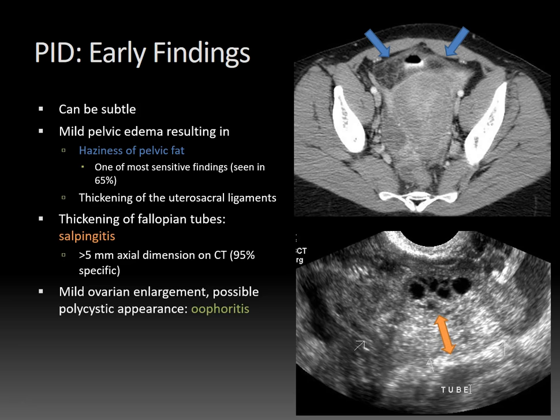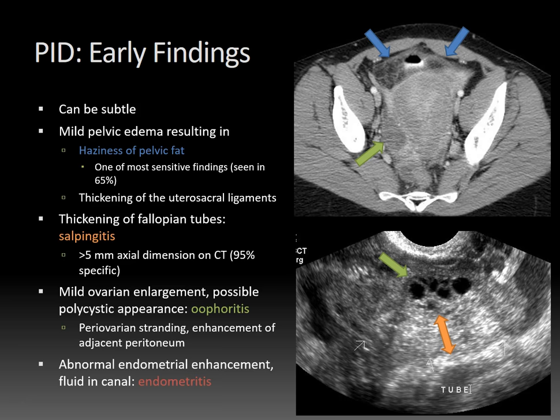Here's an ultrasound case showing that tubal thickening. You might also see mild ovarian enlargement and even a possible polycystic appearance in the setting of oophoritis, or ovarian inflammation, as you can see here. Periovarian stranding and enhancement of the adjacent peritoneum can also occur. Finally, if you have abnormal endometrial enhancement with fluid in the endometrial canal, that can be a sign of early endometritis, as in this case.